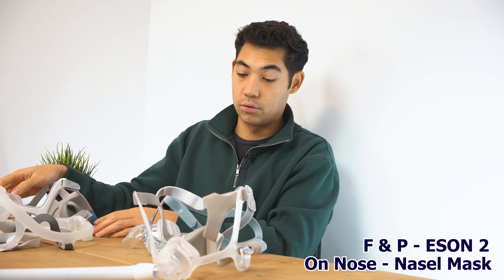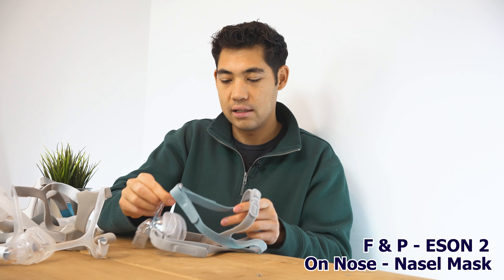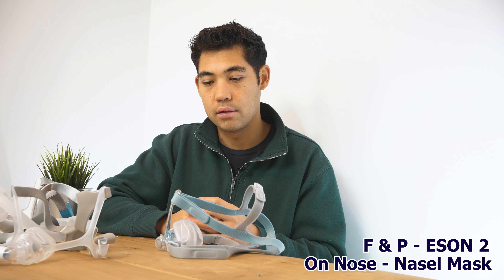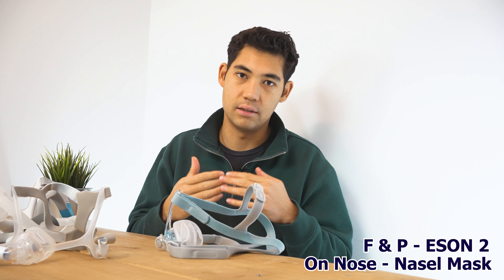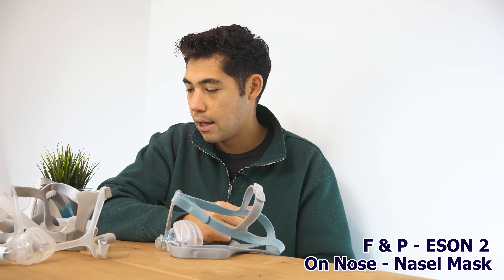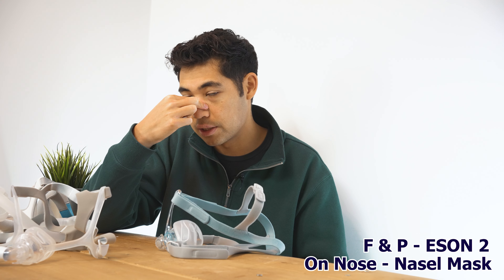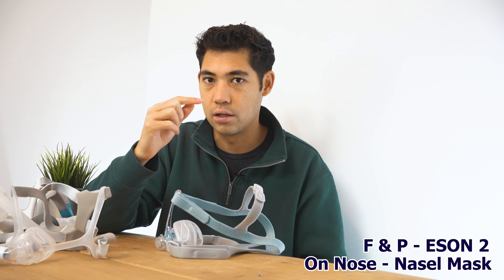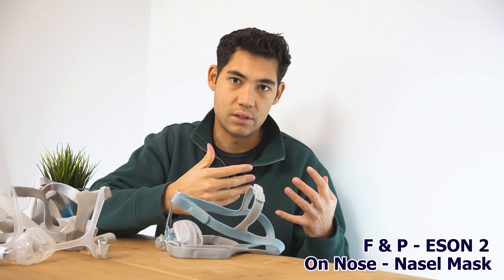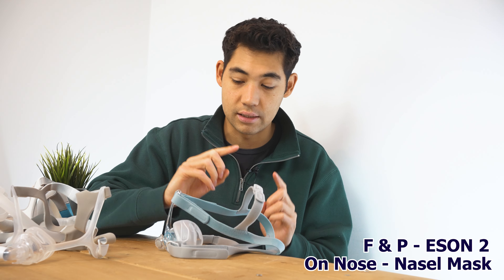The reason I'm changing my pick is that after further consideration I find the Eson 2 fits better on my nose and probably on other people's noses too. This is actually the category I have the least personal experience with because my nose is quite squishy — it has no cartilage — so on-nose masks tend to press on my nose and restrict airflow. The Eson 2 does the least of that.